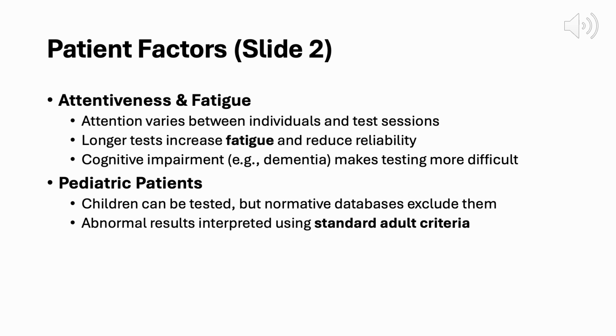Attentiveness and fatigue are major variables. Attention can fluctuate between patients or even within the same patient across sessions. Longer test durations tend to exhaust patients, leading to less reliable results.